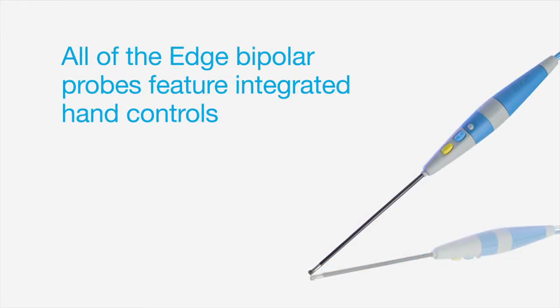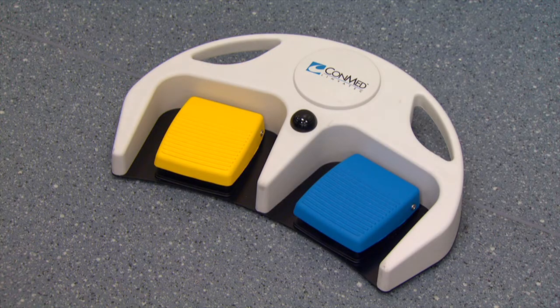All of the Edge bipolar probes feature integrated hand controls. However, connection to a wired or wireless foot controller is available.